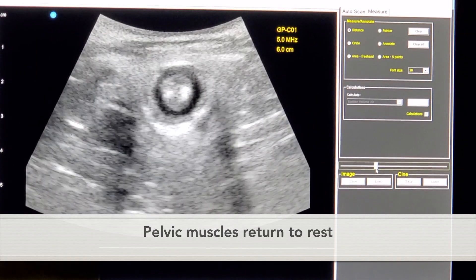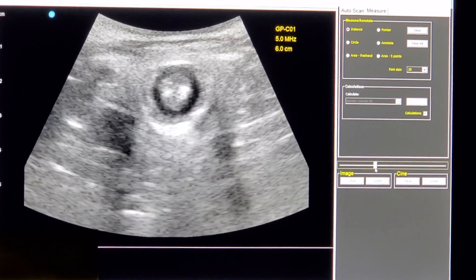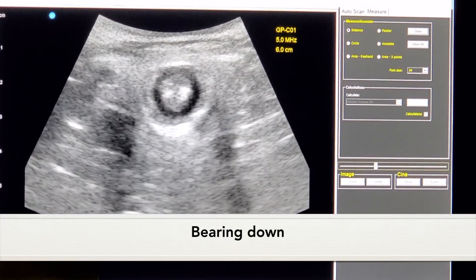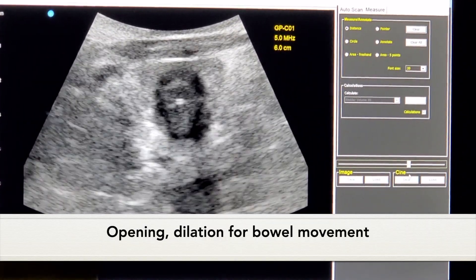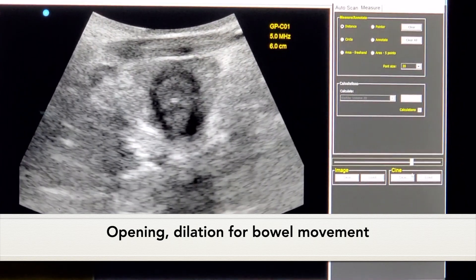And here they are returning to rest. Then the next thing you'll see is the coordination and what should happen when an individual is bearing down. You'll start to see opening and dilation of these tissues and sphincters, widening to open up to allow for a good, complete bowel movement.